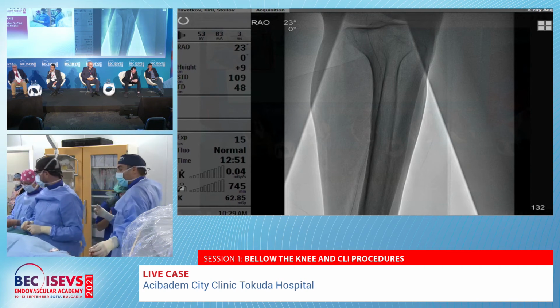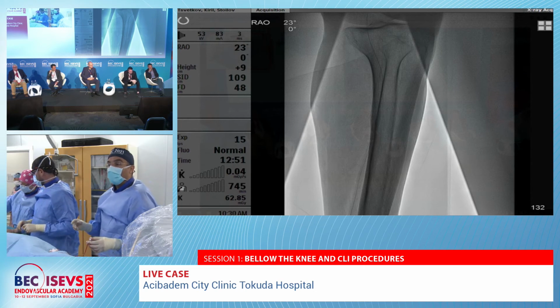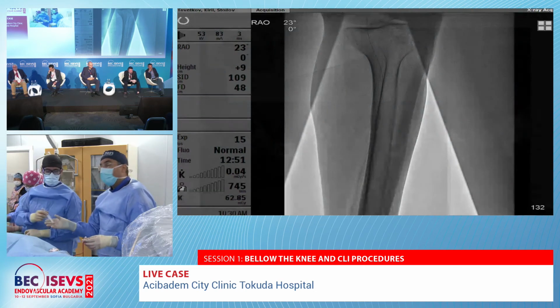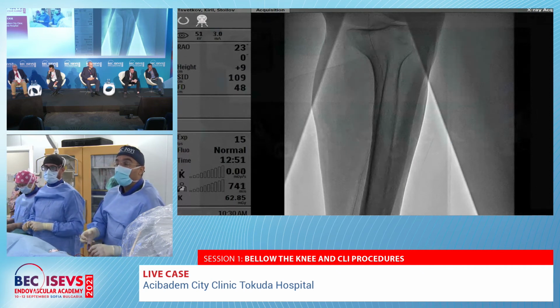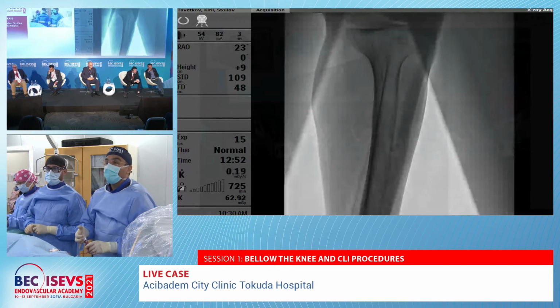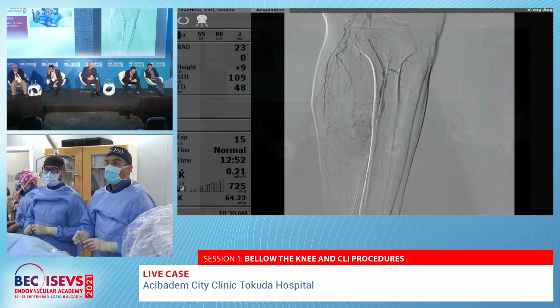That's good. The proximal part seems a bit calcified, but you can also see calcification in the total occlusion part, but your wire went through so easily. I think there was also some kind of thrombus involved in that total occlusion. We will see now. Okay. It's not bad.